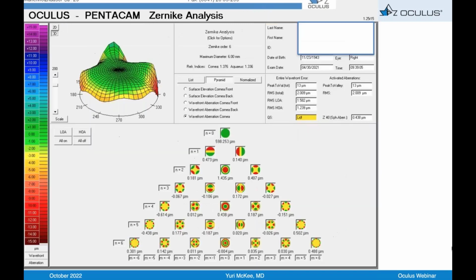You look at that three-dimensional wavefront aberration cornea, that's got that specific, almost saddle look where it drops off on the right and left-hand side, but on the top and the bottom, you see it pick up. This was probably a mixed astigmatism LASIK ablation profile.